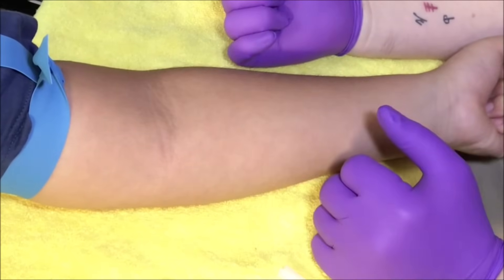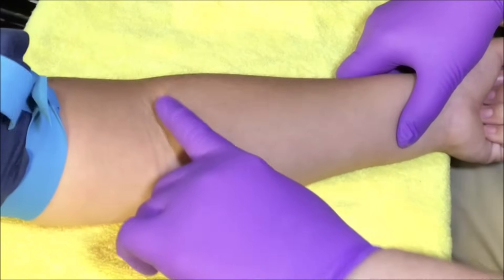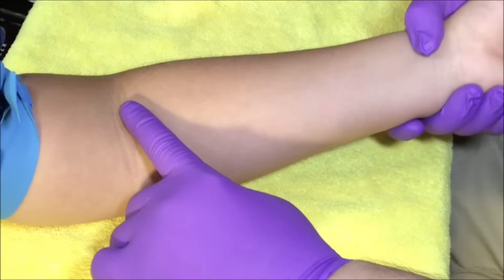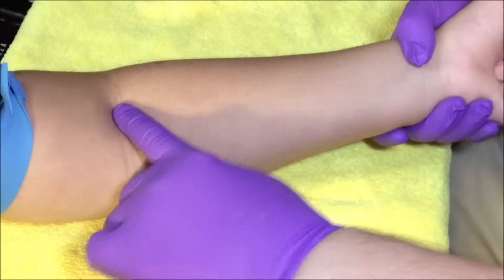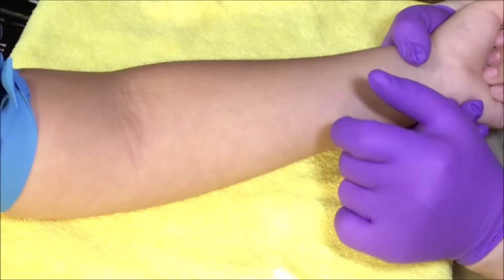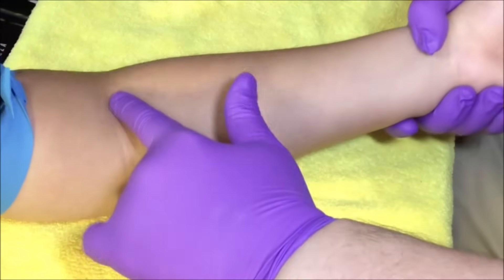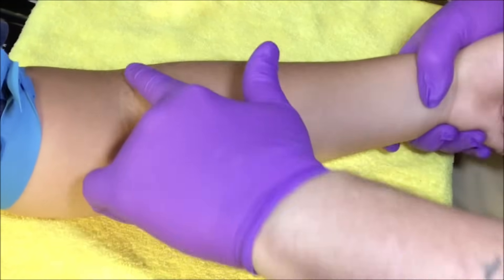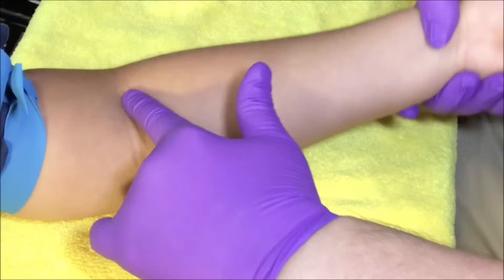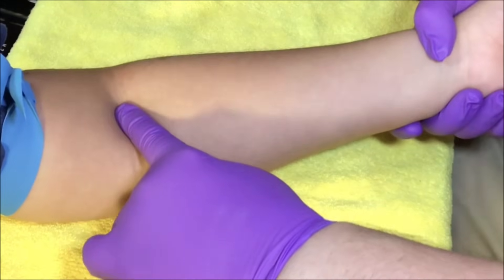I'll have them just close the fist and squeeze a little tighter, and that helps the vein stand up a little bit. Then I'll start to palpate and locate a vein. If I'm having a hard time, I'll take the wrist and slightly bend the arm up as I'm palpating the area. Make sure you know anatomically where your veins are — the median cubital, the cephalic, and the basilic vein. Pushing in those areas and slightly bending the arm will help you feel the vein as it moves.